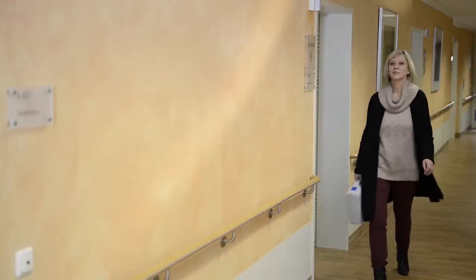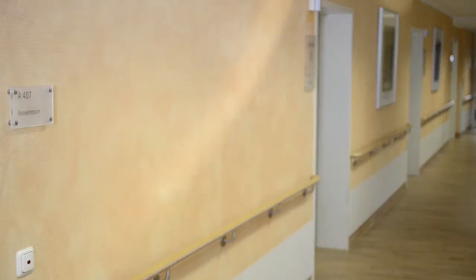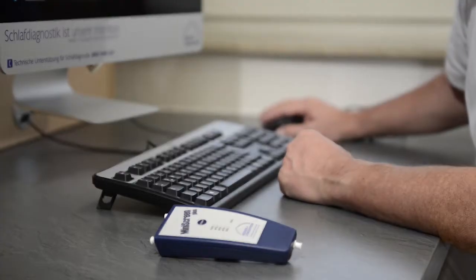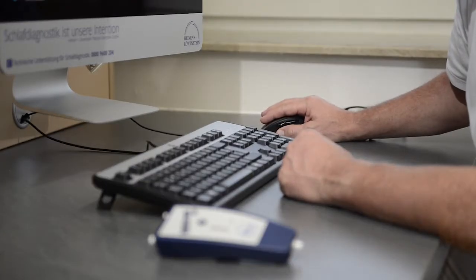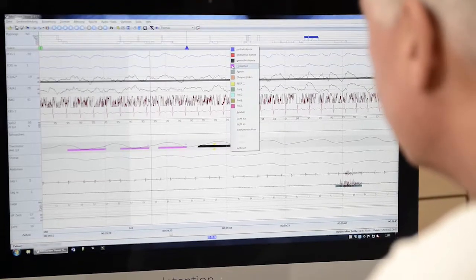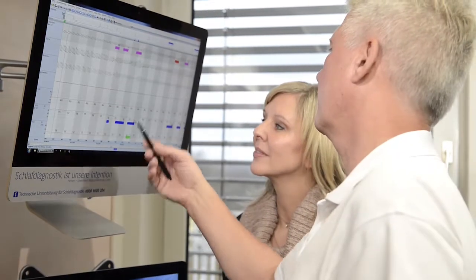The next morning, the device should be returned to the clinician for the analysis and for detecting potential desaturations and apneas. Using this method, it can be ascertained whether the apneas are the reasons for the symptoms. The patient is also given a polygraph report in which any possible apneas, as well as the oxygenation during the night, are highlighted.